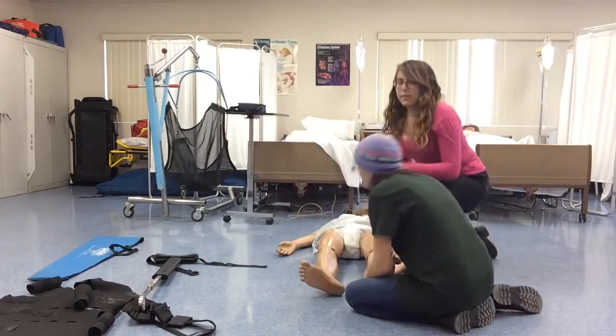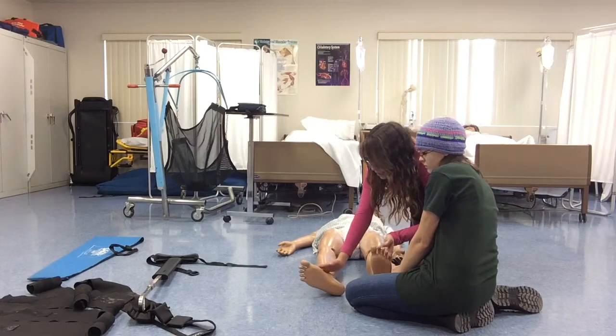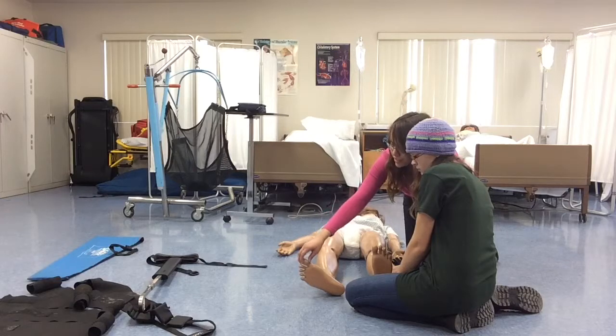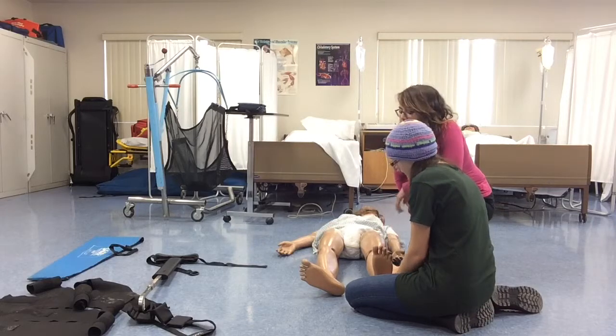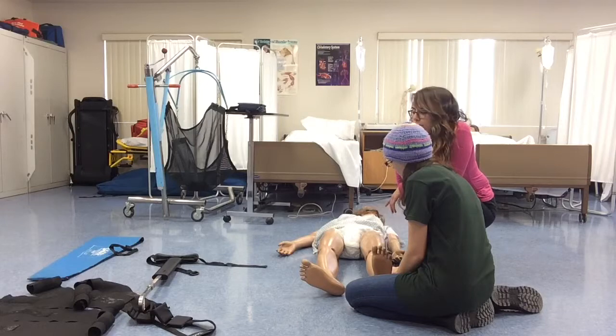So, I'm going to be checking for PMSS. So, I'm going to check for her pulse. Okay, that's good. Push down. Push up. Okay, closing your eyes, what toe am I touching? Big toe. Closing your eyes, what toe am I touching? My big toe. Okay, and then can you move your toes for me? Okay, so that's all good. So, she doesn't have any other injuries, so I'm going to be applying a unipolar traction splint.